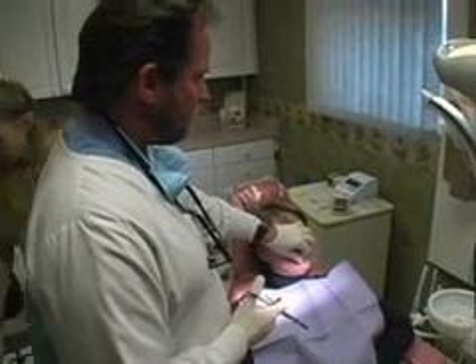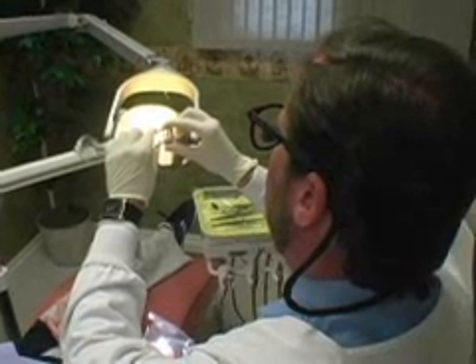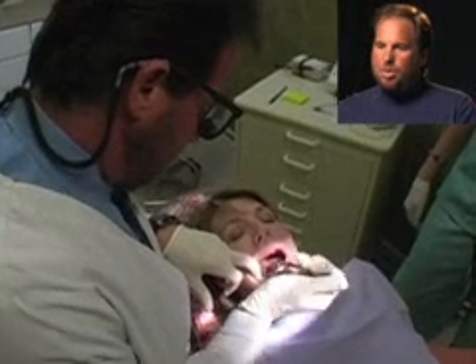The first thing I'm going to do is numb up Sheila. We're going to use lidocaine 2%. We'll give a painless injection with a thin needle. We'll check the X-ray so we know what we're doing.